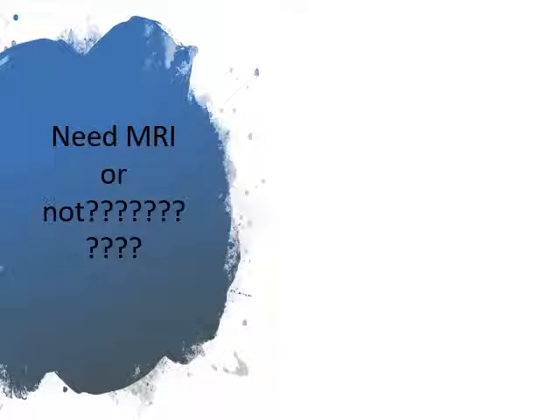If the patient came to the ER with right side hemiparesis, for example, and we had a CT brain, what do you expect to find? If the patient has a hemorrhagic stroke, we will see blood from the first CT in the presentation, the hyperdense lesion of the blood.